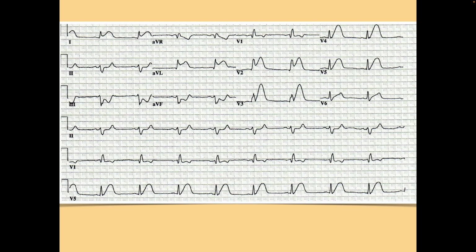So Spencer, looking at that, is there enough information there to go to the cath lab? Is there a STEMI? And if so, what is it? Do you have ST elevation in 2 or more contiguous leads? Just off the bat, you've got it in leads 1 and aVL. Good. So 1 and aVL, and what do we call that? Inferior lead is underneath, so what is it?